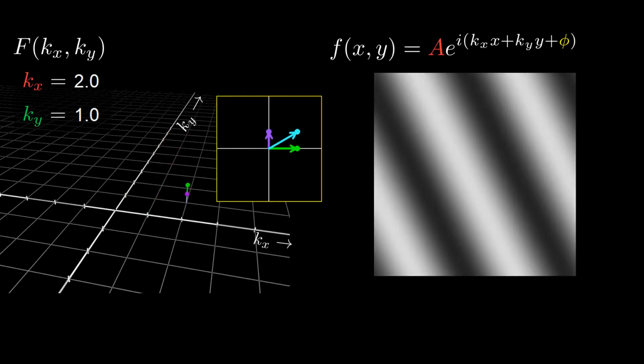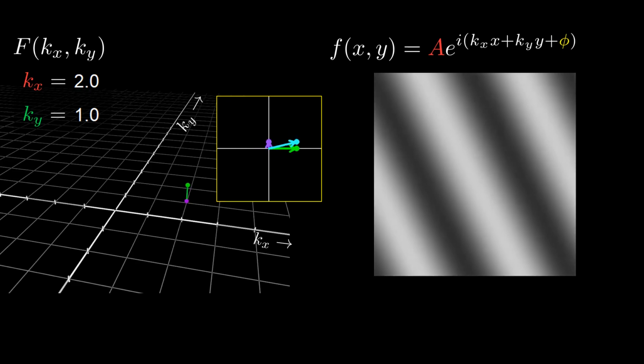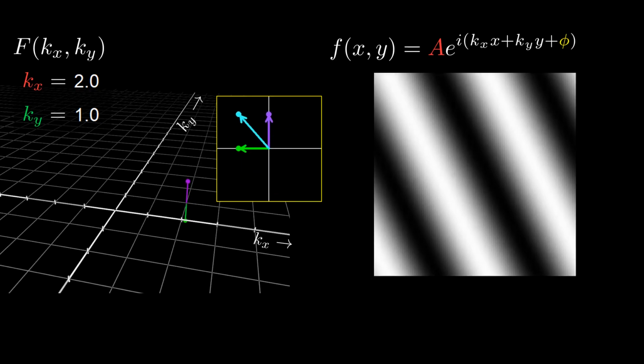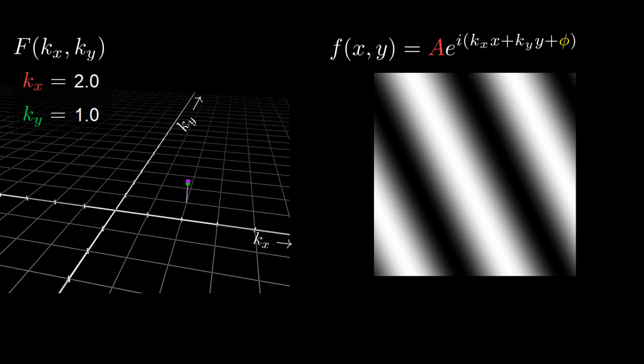And here's the same animation of our phasor scaling and shifting the 2D sinusoid. Notice that when the phasor amplitude is low, the sinusoid stripe pattern becomes less pronounced. This is because the amplitude is lower, and so the range of brightness values spans a smaller portion of our grayscale. Finally, just like with our 1D functions, our image f of xy is the element-wise sum of all the scaled and shifted 2D sinusoids dictated by our kSpace phasor function.